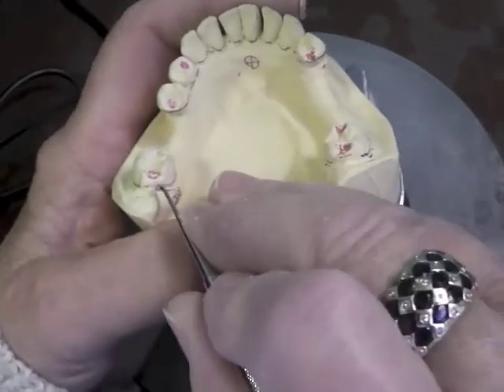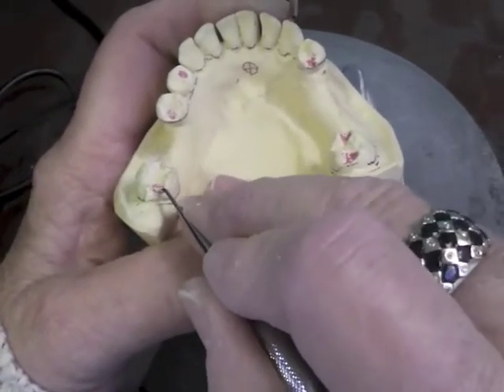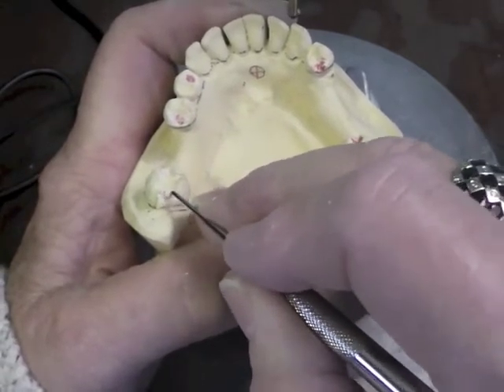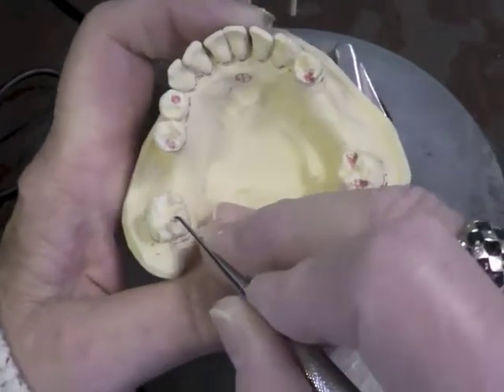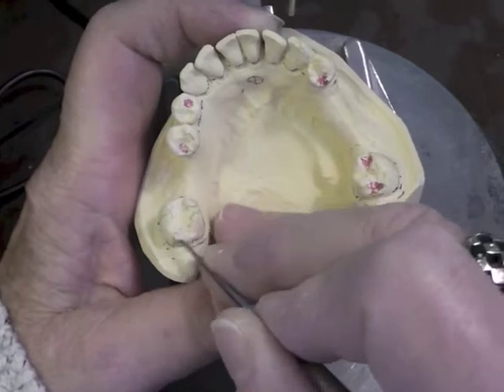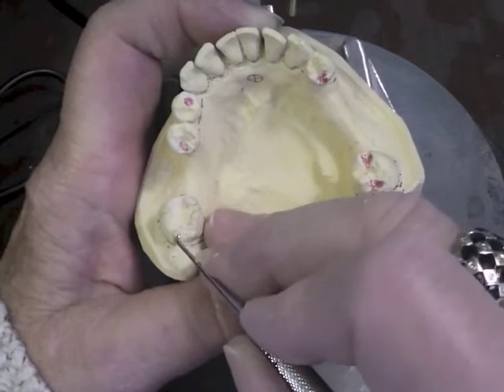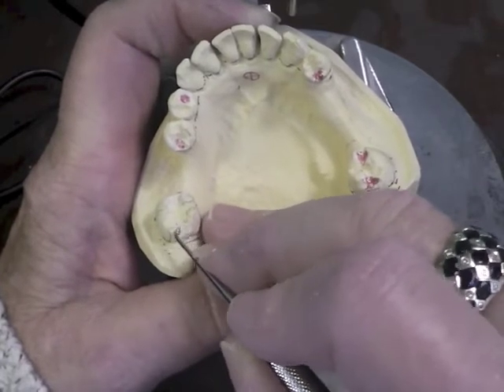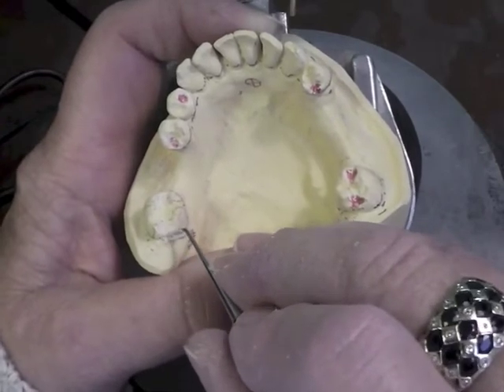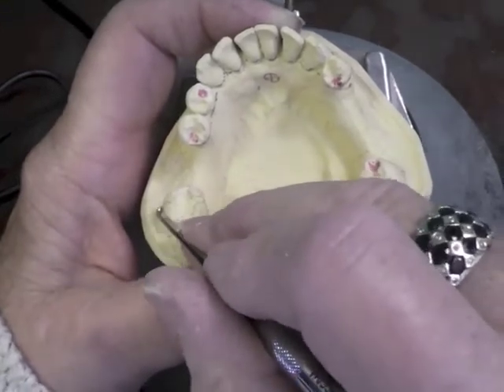Coming back here, I don't have any problem with a guiding plate in this area or a high survey line, so I'm just going to go ahead. Oftentimes you will find that this particular area is really in heavy occlusion with the opposing arch and requires more reduction of the tooth in order to get metal. You've got to have at least a millimeter thick area of metal for this rest — minimum of a millimeter — so that it doesn't break.